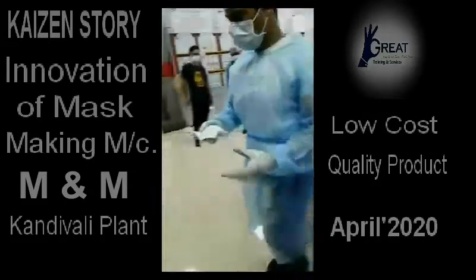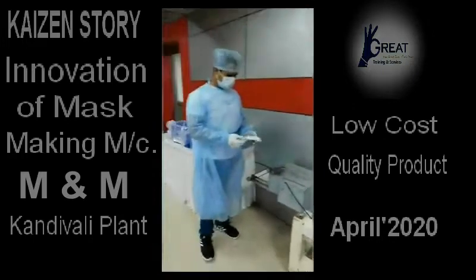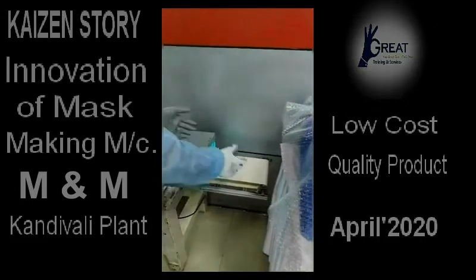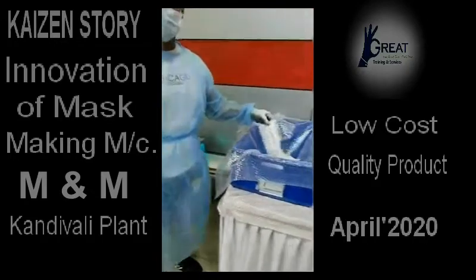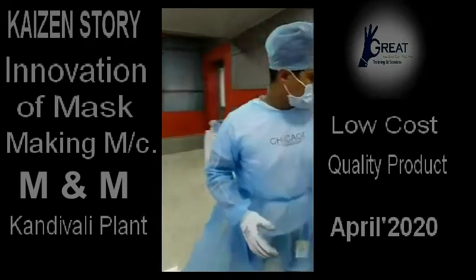After that, the final product goes into the UV sterilizer. It needs ear loop bending, then we keep it here and within 5-6 seconds it will travel from here to here. You will get the final product from the other end. Five seconds is sufficient for removing all the germs and bacteria from the mask. That is our final product.